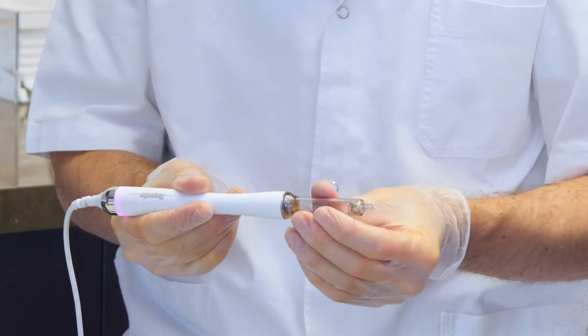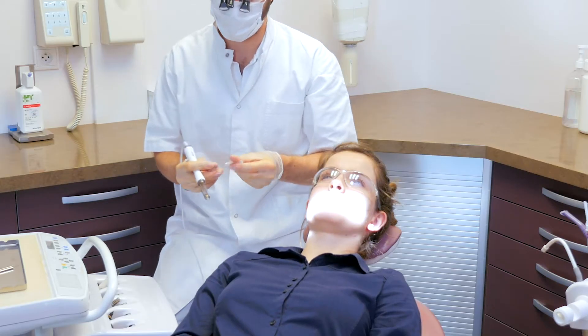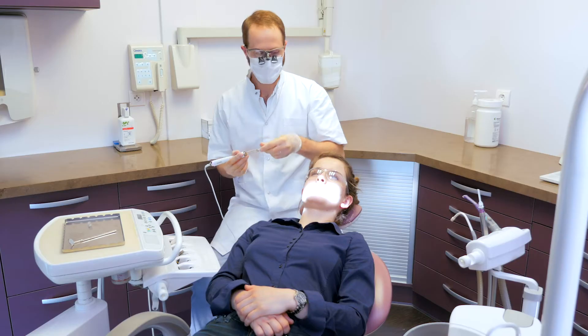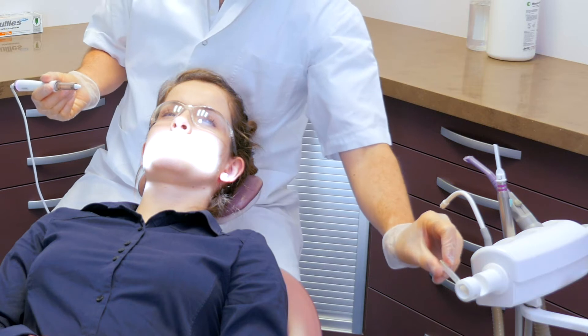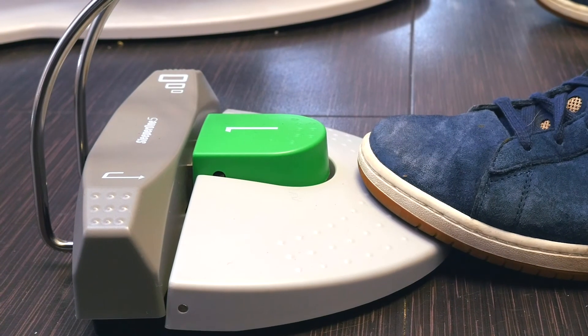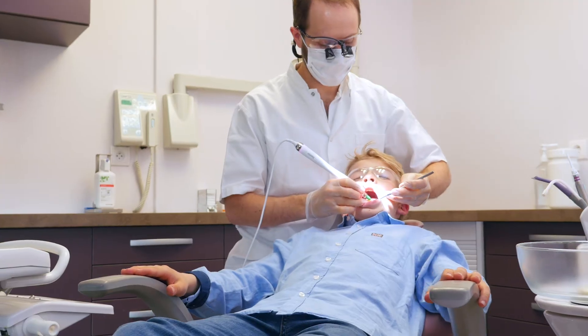Sleeper One Five is easily installed on your unit and ready to use at all times. It is an excellent alternative to your manual and ratchet syringes. The wireless pedal is also batteryless and can be easily moved away when not being used.